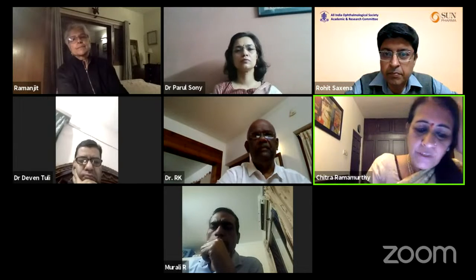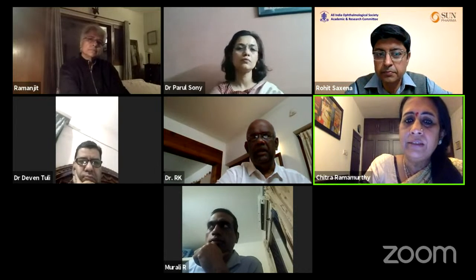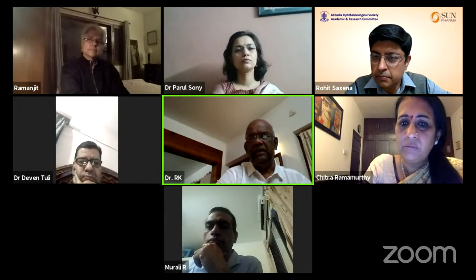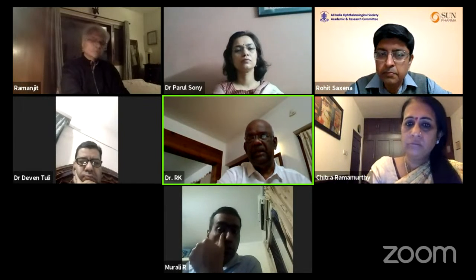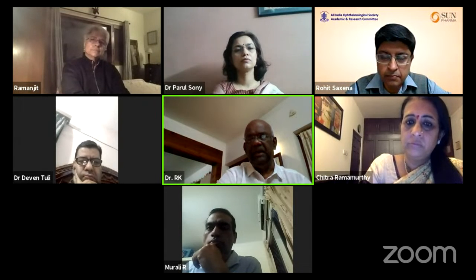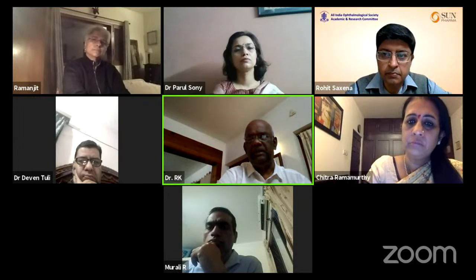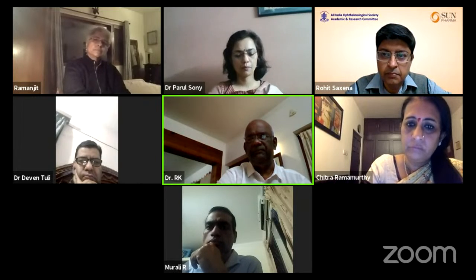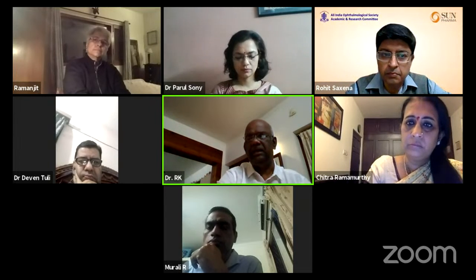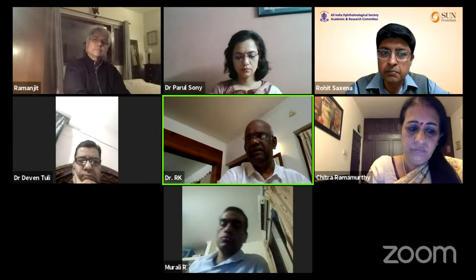Dr. Ramakrishnan, how many fields would you feel is needed for a baseline understanding? Yeah, it's a very good question, Chitra. No, it's not the number of fields. Suppose the field correlates with your optic changes, then I will take it as reliable even with the first field itself. If I'm not happy, not correlating with the optic nerve changes, I used to repeat the field, not on the same day.